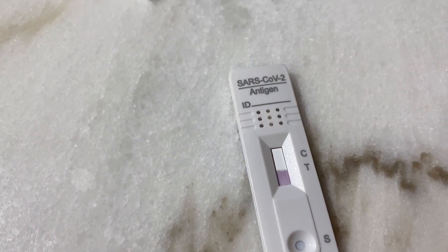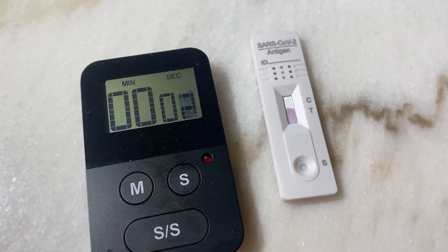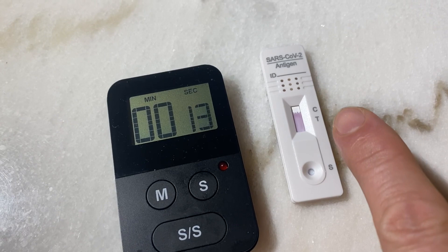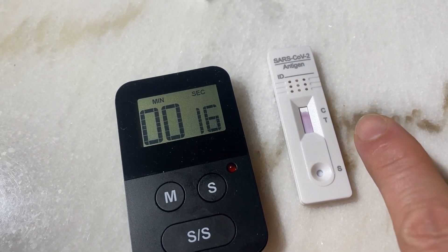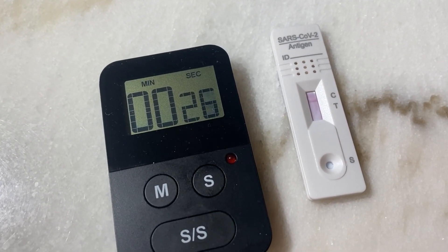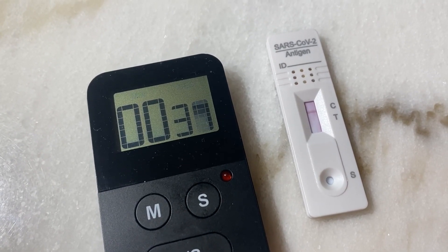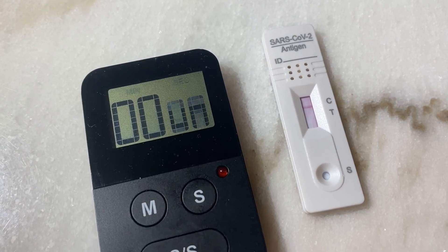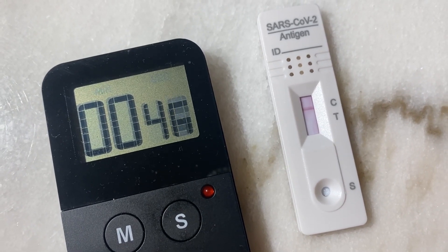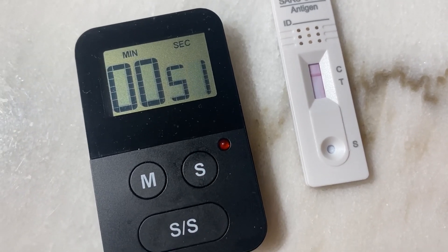Put on the stopwatch and wait. You can see now how the liquid is spreading upwards on the paper device inside. Hopefully you don't get a line by the T, because a line at T indicates you have COVID-19. If you get a line at C, that indicates the test is negative — you don't have COVID-19. To be sure, you have to wait 15 to 20 minutes.